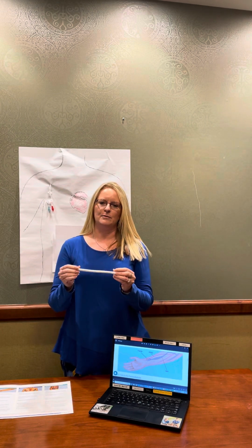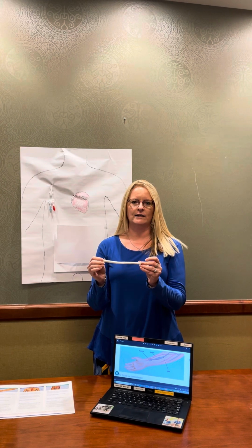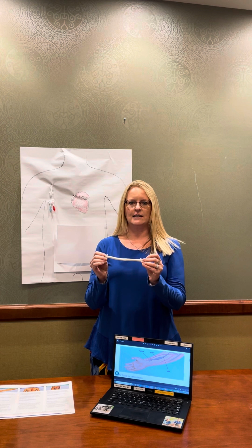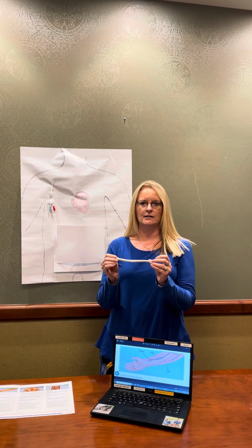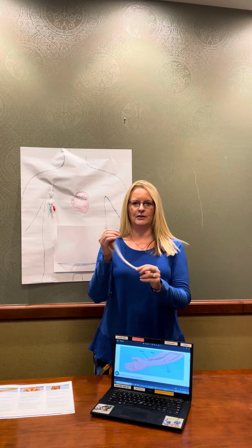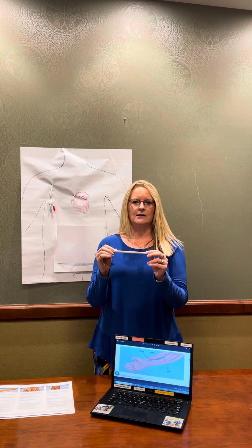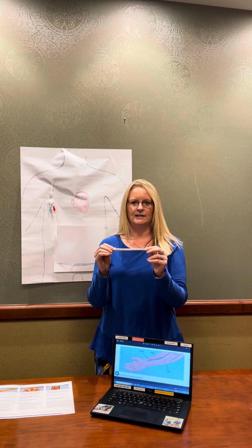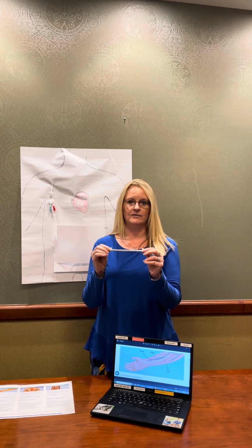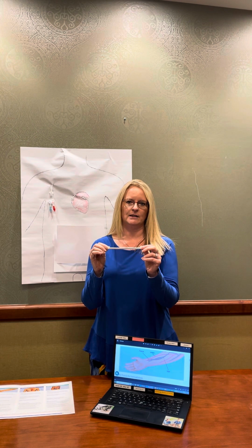Our second type of access is the graft, and in front of me I am holding a graft segment. Through an outpatient procedure, this segment would be surgically connecting a patient's artery and vein. As you can see, it is very pliable. This is the second preferred method for a dialysis treatment. Its lifespan is not as long as a fistula, but it still has many pros to keep it at the top of the list.